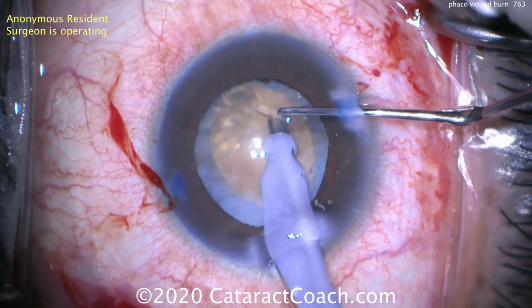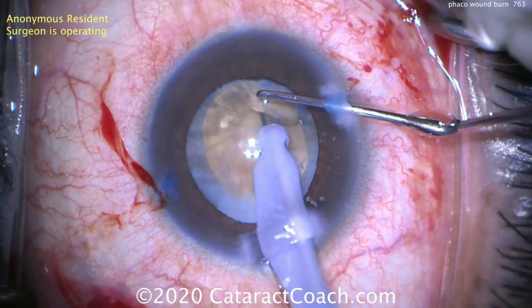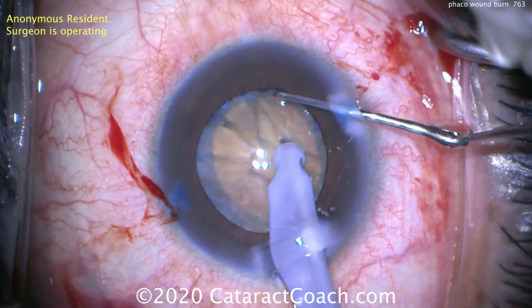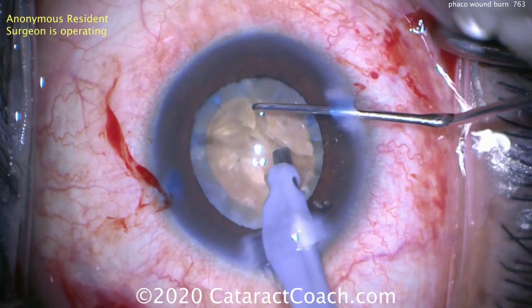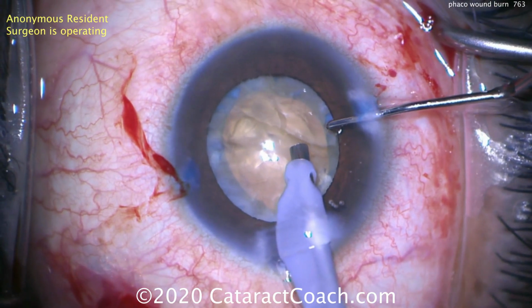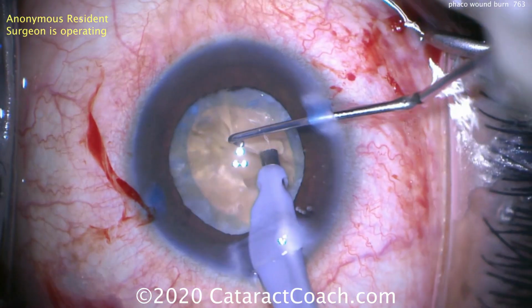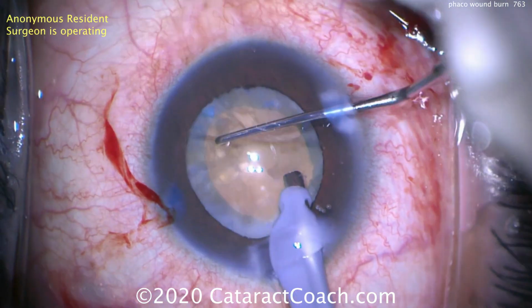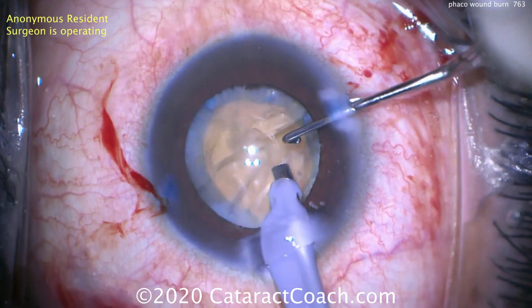Look at the position of the phaco probe. Why is it up against the right side of the incision? Do you see the needle within the purple sleeve? The needle is also pushed right up against the corneal wall there, the wall of the incision. That's not good. You're supposed to float within the incision, but in this case, we're not floating in the incision.